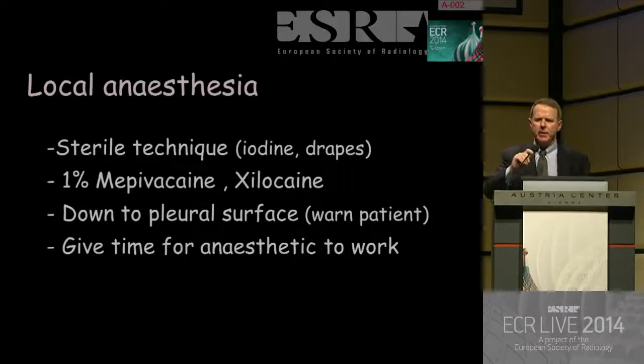Many times during biopsies, we give the injection, make the anesthesia, and we start the procedure right away in 30 seconds. You know? Look, do like the dentist does. Give the anesthesia, go and talk with the nurse, come back in 2 minutes, and then start the procedure.